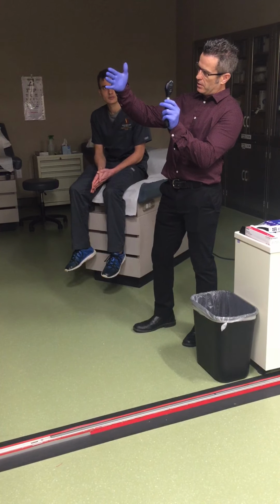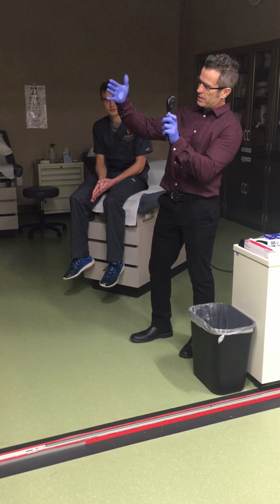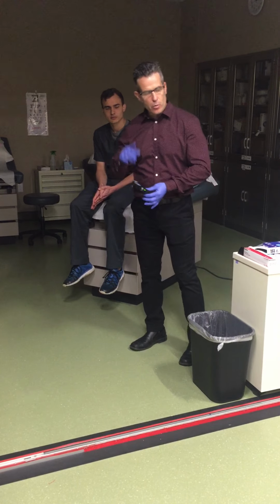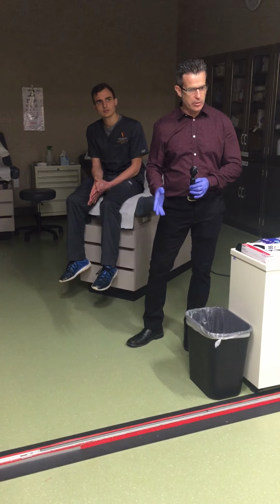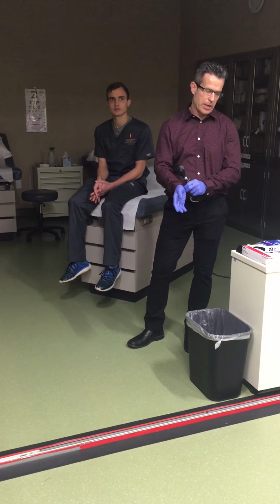Notice that dimmed it. If I twist, you just got to let it go when you're ready. So I want it slightly dimmed. Alright, so remember we're looking at the far structures is what we're concerned about, not the close structures. Close structures, we try to read our palm print, okay?